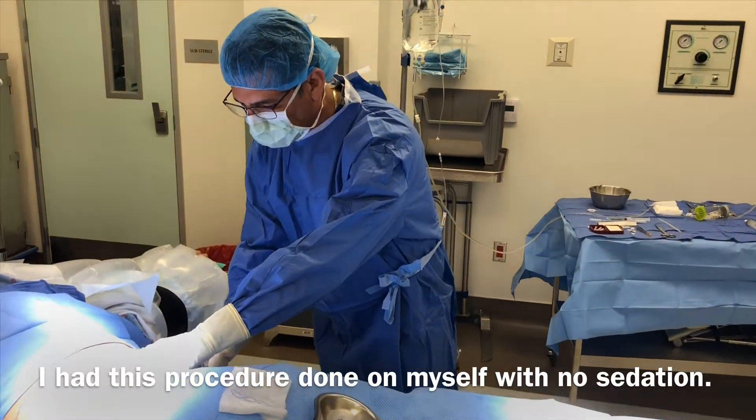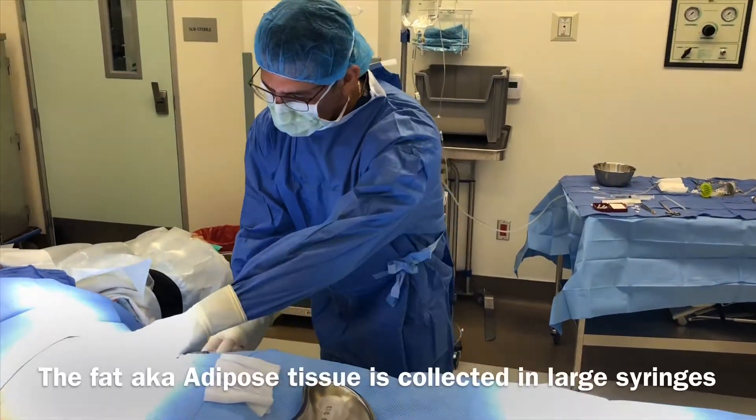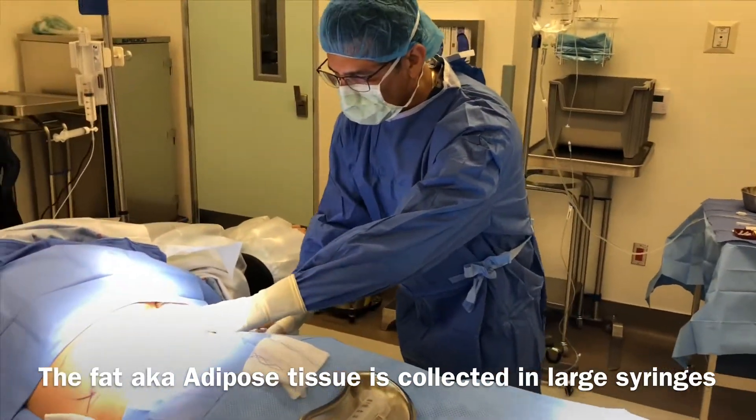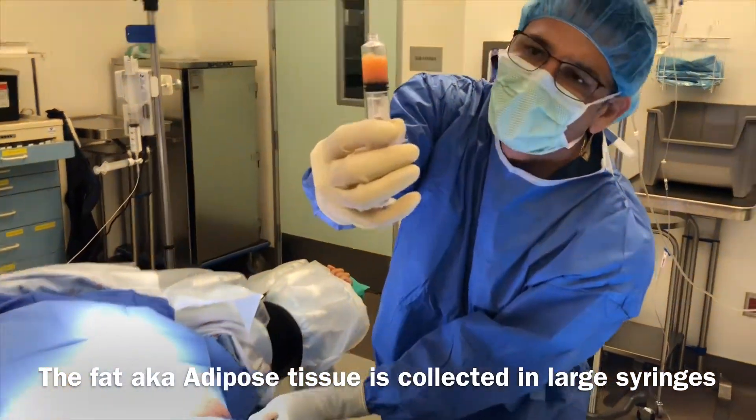It gets fat in here. I'll show you what it looks like as I do this. So this is what it's going to look like — this is the fat that I'm taking out. Can you zoom in on that? That's the adipose tissue and we'll be putting that through the canister in a second.